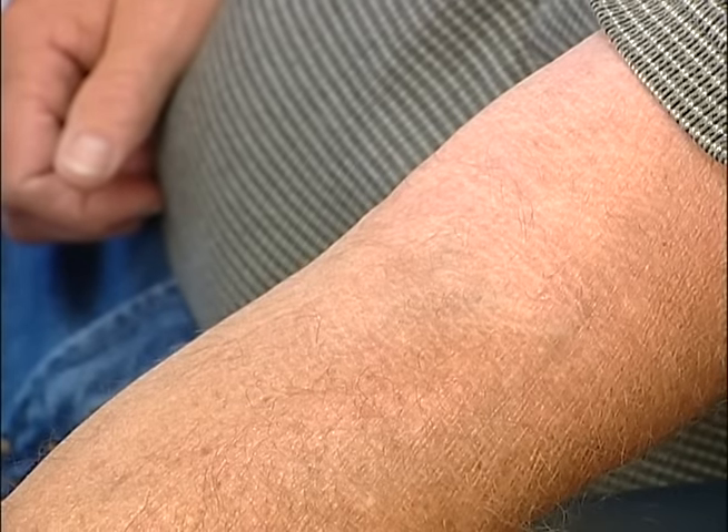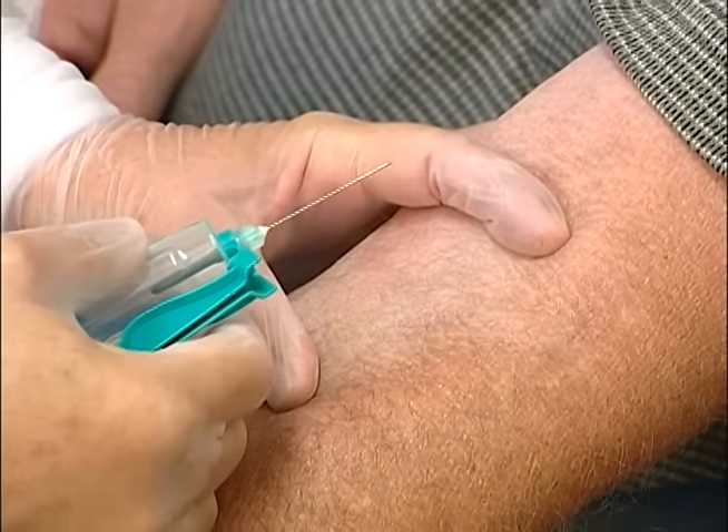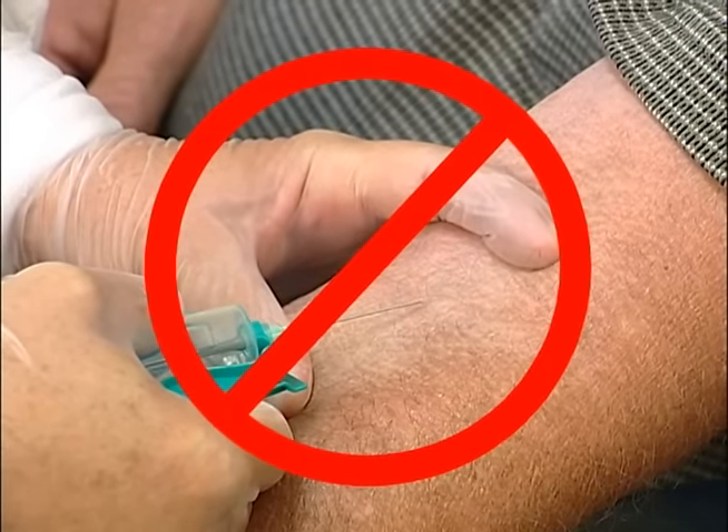Do not anchor the vein from above, as shown here. This puts your index finger ahead of the needle and in harm's way should the patient jump upon needle insertion.